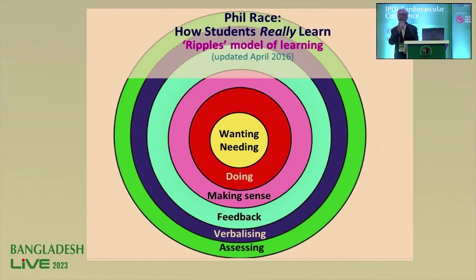So how we wanted them to learn. At the center, you can see there should be a need for one. Every person interested in echocardiography, especially the echocardiographer, is interested in doing imaging. They try to use the knobs so that they bring a good picture. That interest is there, that we know. On top of that, we put some preliminary assessment questions. Those questions evoked interest in them, and they were interested in knowing about those terms. Although these terms may be very familiar to you, for the beginner some of them were not that familiar. So they will get some interest in those terms, and they will try to learn and execute them.